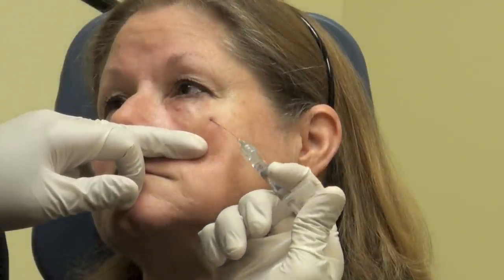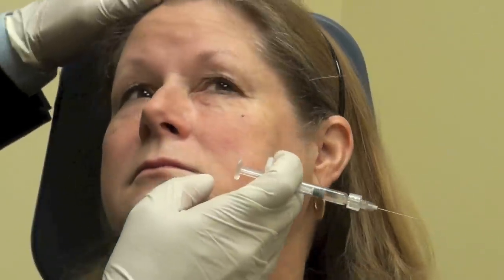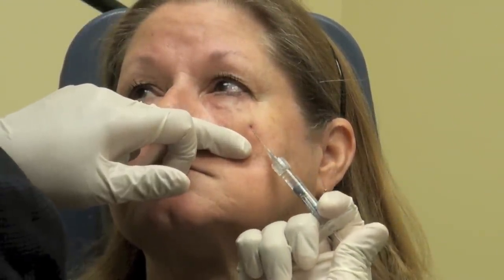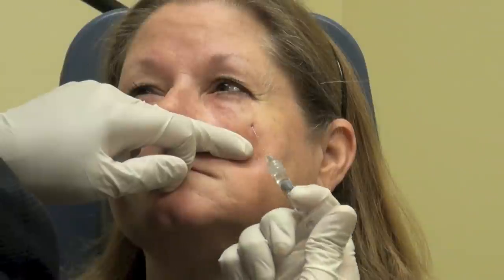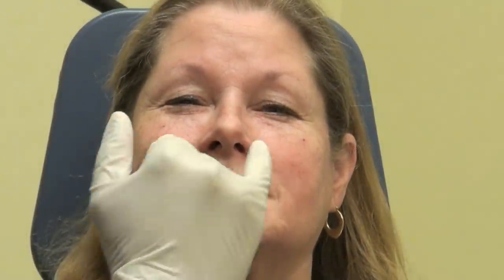You'll feel this a little bit at the very beginning; it'll settle right down. The noises are interesting, aren't they — how it sounds. So much better. Just a little bit more of the inside corner, so I'm going to go back around there and treat that.